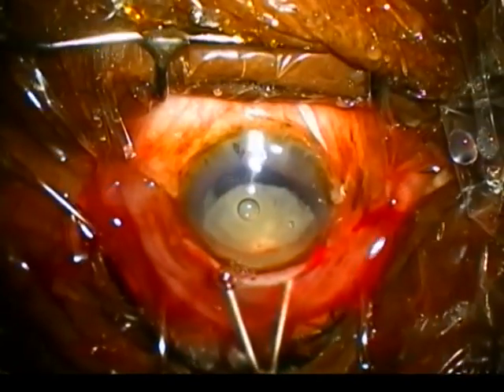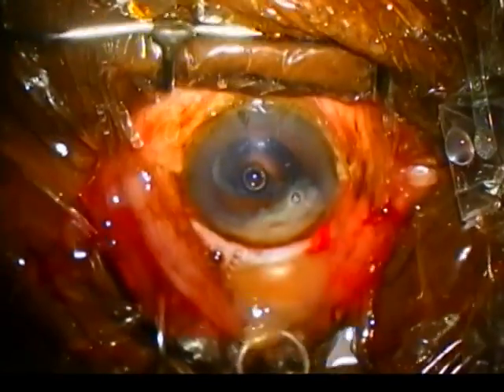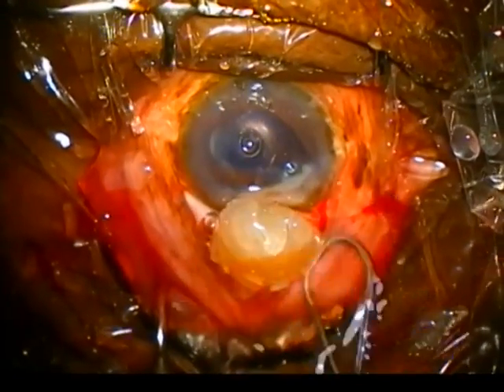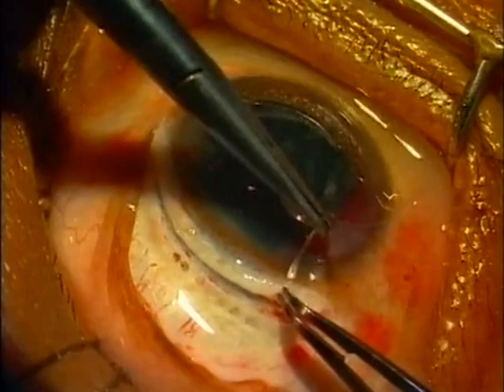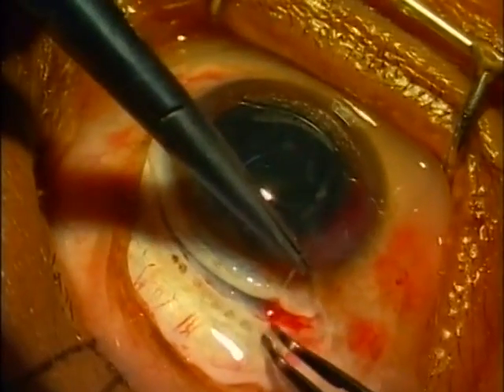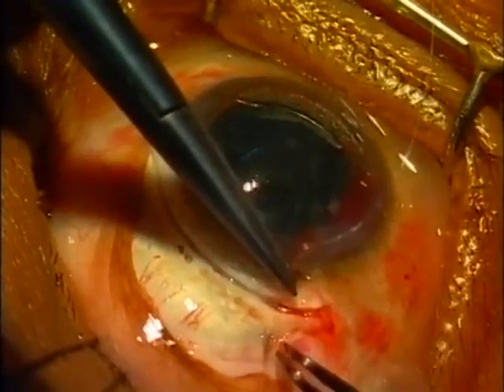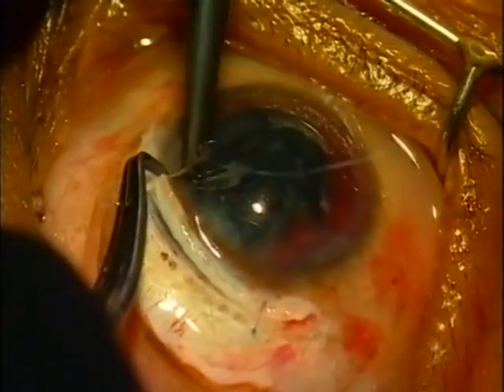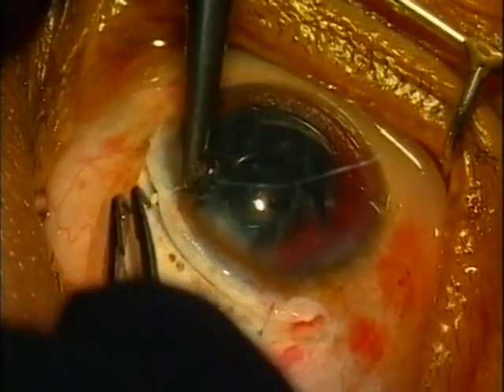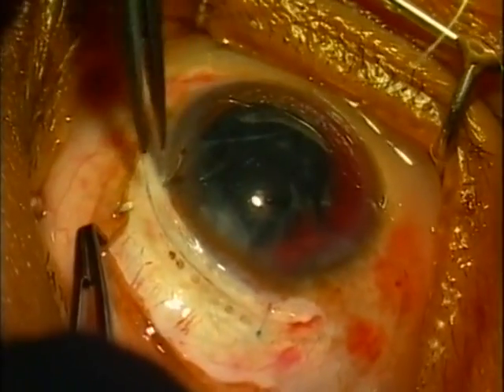The eye is rotated downwards using tooth forceps, either as shown here or placed at the lower limbus. After the nucleus has been removed, a suture is placed near each end of the wound to help begin the closure. These sutures, like all corneoscleral sutures, must be radial and not too tight, or they will distort the cornea causing astigmatism.